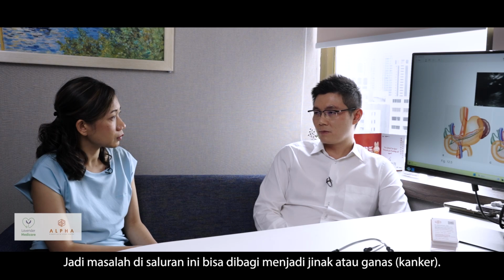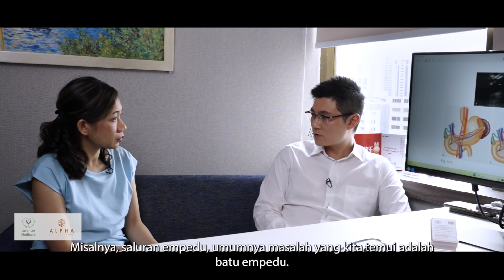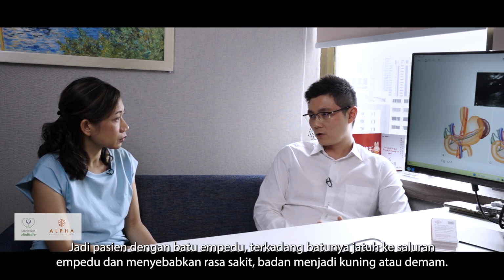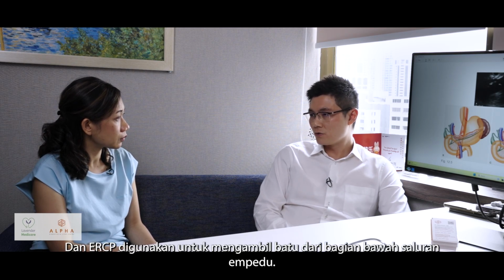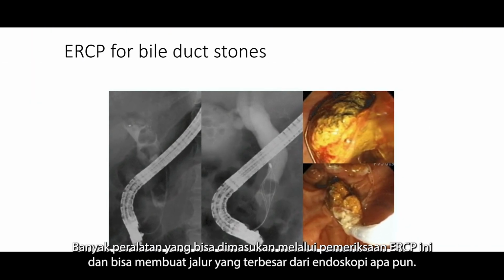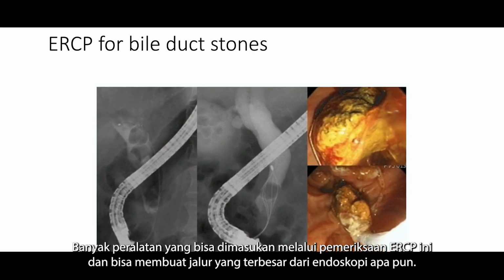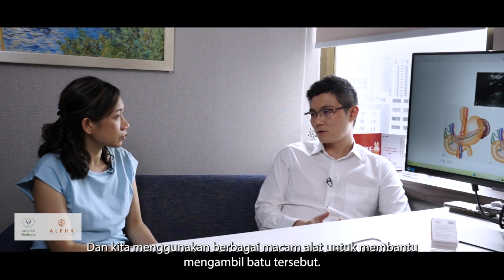So the diseases can be divided into benign and malignant or cancerous problems. For instance, in the bile duct, the most common problem we deal with would be common bile duct stones. For patients with gallbladder stones, sometimes the stones spill out into the common bile duct and cause pain, jaundice or fever. And then ERCP is being used to remove the stones from the bottom of the bile duct. We will show pictures again. And there are many instruments which can be passed through this ERCP scope. It's got a very big channel, the biggest channel in any endoscope. And then we can use a variety of instruments to help us to remove the stone.